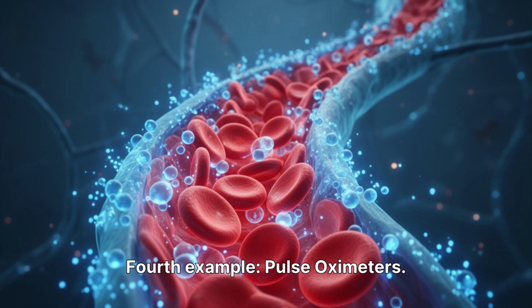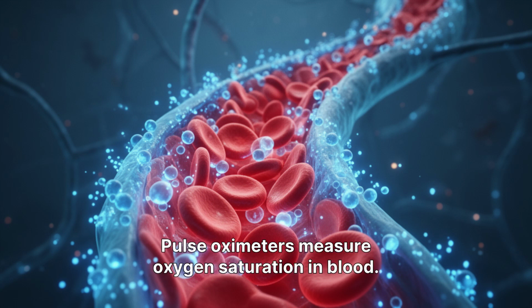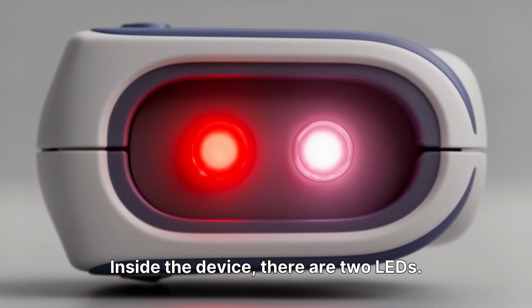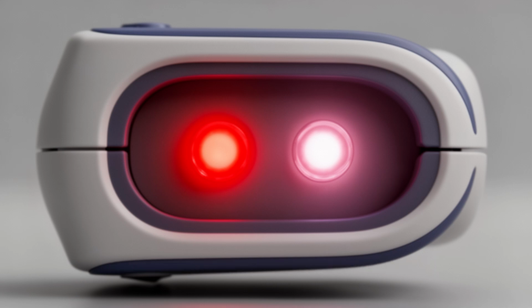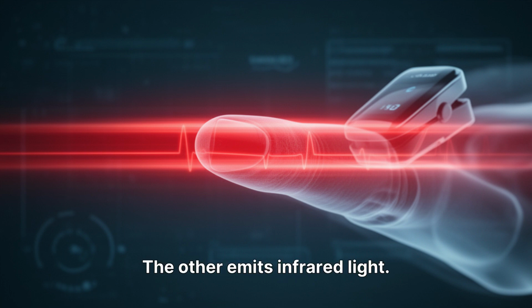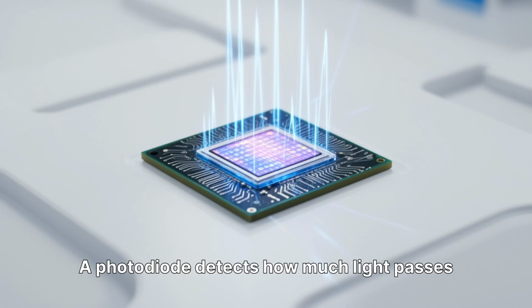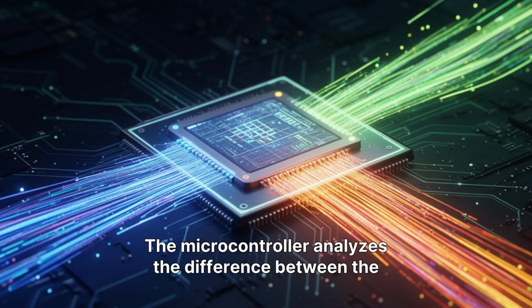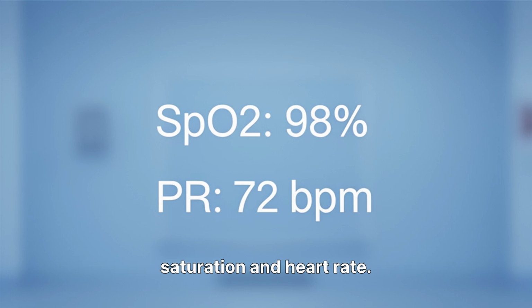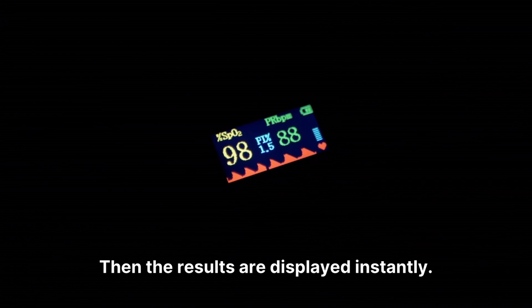Fourth example, pulse oximeters. Pulse oximeters measure oxygen saturation in blood. You usually clip them onto your finger. Inside the device, there are two LEDs. One emits red light. The other emits infrared light. A photodiode detects how much light passes through the finger. The microcontroller analyzes the difference between the two signals. Using this data, the device calculates oxygen saturation and heart rate. Then the results are displayed instantly.